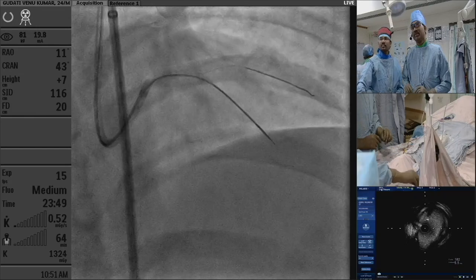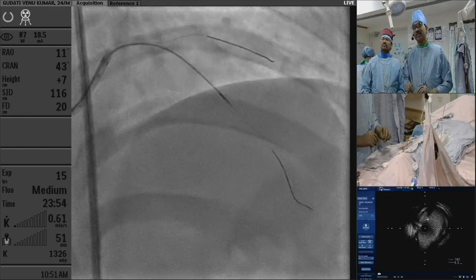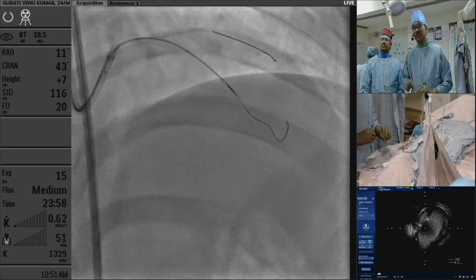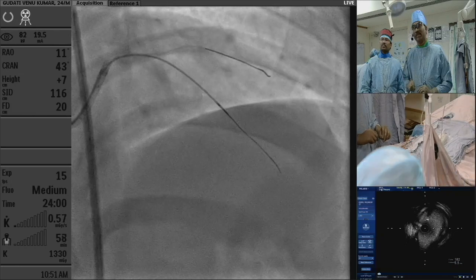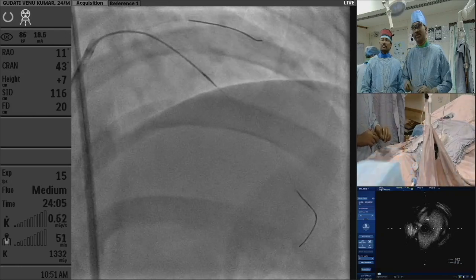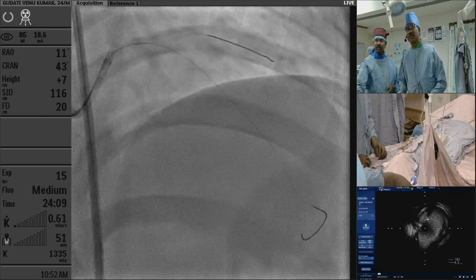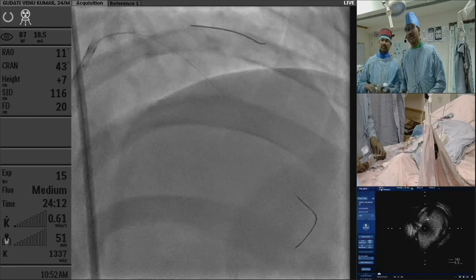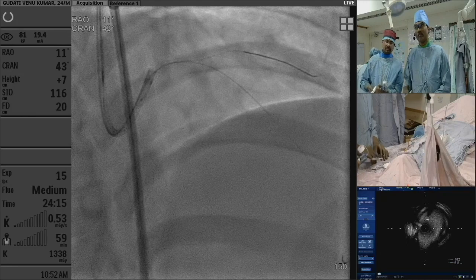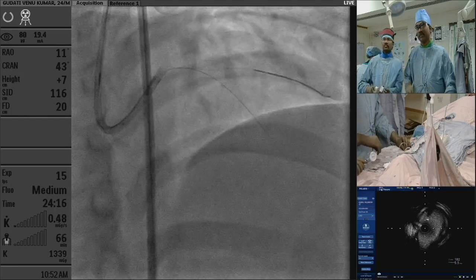So yeah, I can see now. So that's a big LAD, huge LAD. Okay. So it's going into all branches, which confirms your, okay, perfect. Okay, trap, please. Okay, right. Negative. Oh, no, wait.